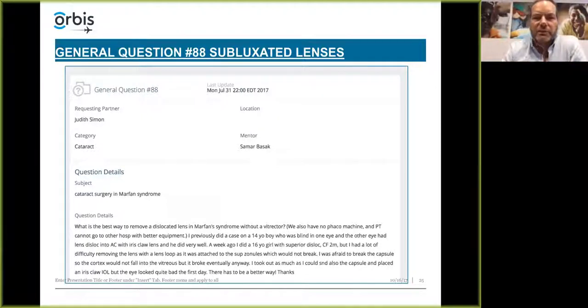One of the things, let me pop back up to our questions. We have a couple more, it looks like. So that was the extent of anterior vitrectomy. What should the surgeon do if the posterior capsule breaks during injection of the IOL, and also, is a 3-piece IOL better for eventual future explantation?